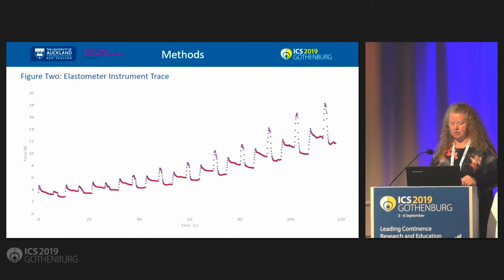This figure demonstrates a typical trace over one cycle with 10 step phases of 10-second duration. The step phase is highlighted here. The peak of the step phase is the MVC of the participant.